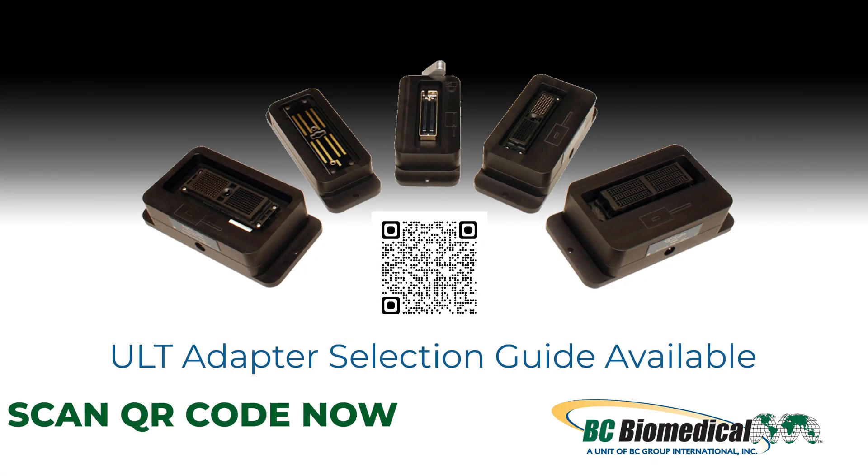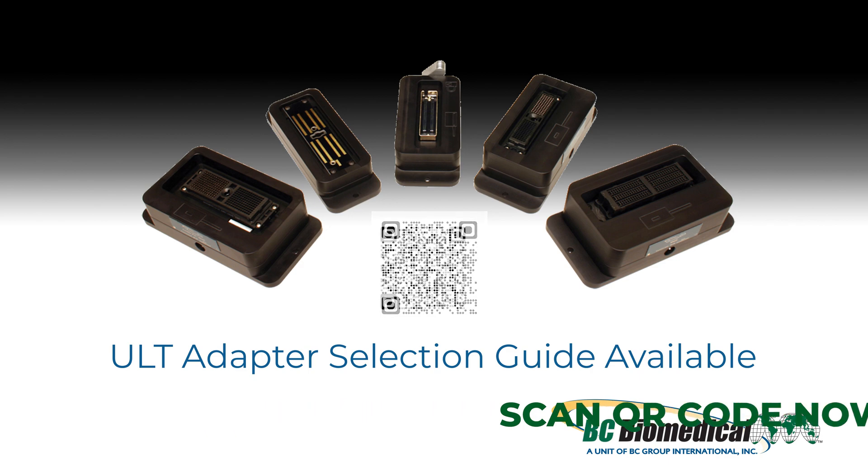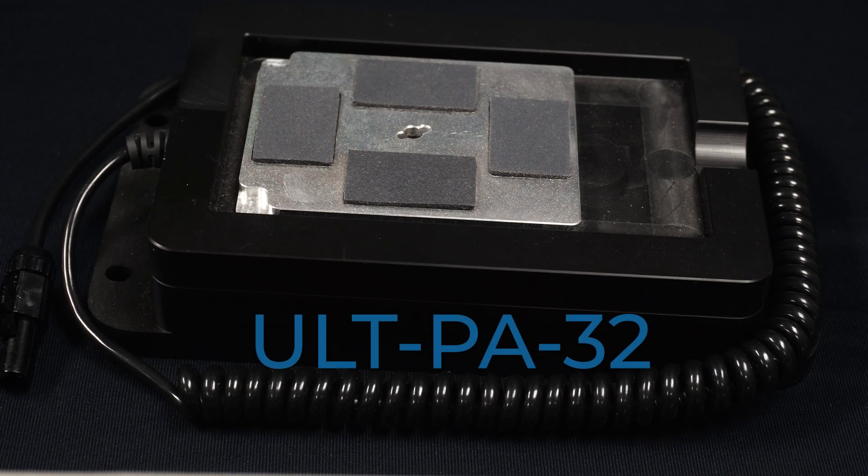You will also need an appropriate transducer adapter. Since we are using the Sonosight T8-3 transducer you will need to use the ULT-PA32 like we are in this demonstration.